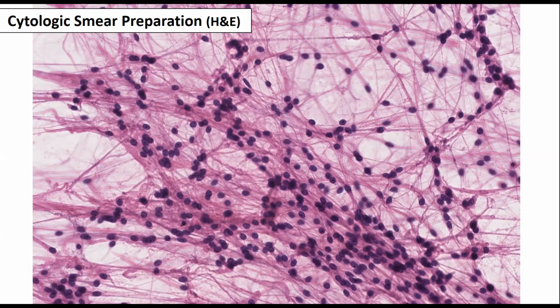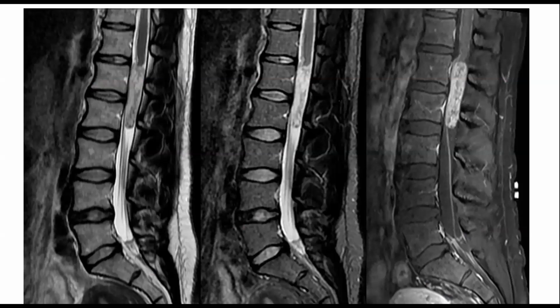If it's in the lumbar cistern, it will be a circumscribed mass ranging from spherical to elongated boxcar or sausage shaped. That's the full range of morphology in the lumbar cistern, arising from either the conus medullaris or most commonly filum terminale, or least commonly one of the spinal nerve roots, and that'd be myxopapillary ependymoma, and that's what this case is. So in this particular case, this is myxopapillary ependymoma. There you can see it, boxcar, arising right at the junction of the filum with the conus. That's going to be the single most common location. And you can see on the right, filum going all the way down.